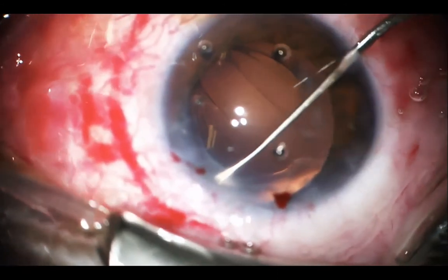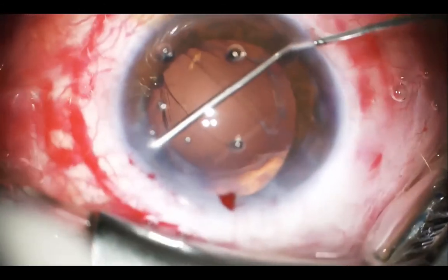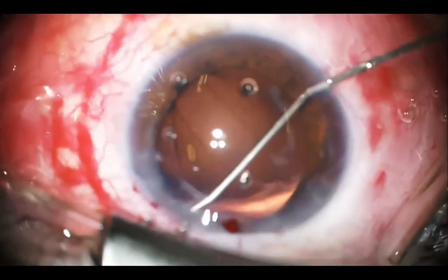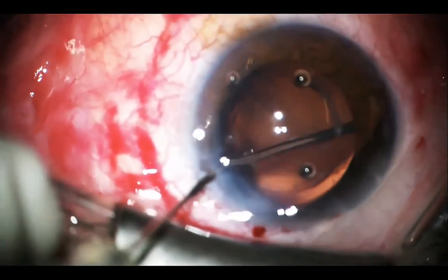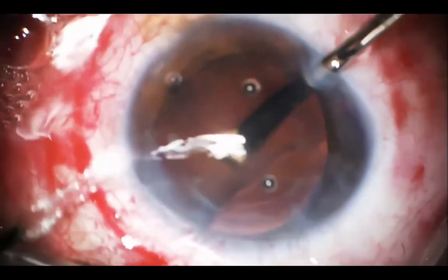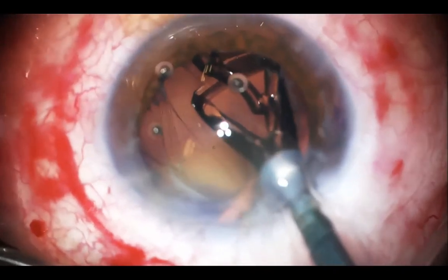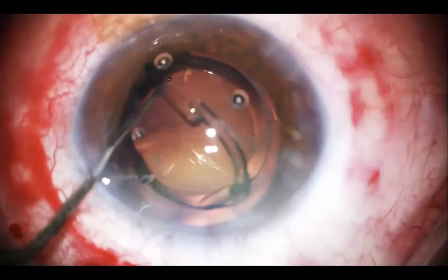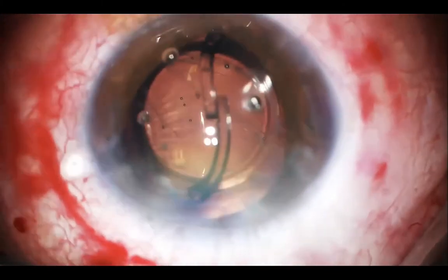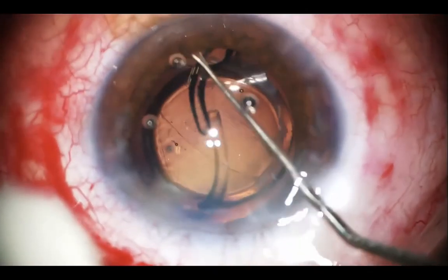So as you can see here, I'm doing the same maneuver on the other side. And it's not necessary to completely dissect the anterior and posterior capsular adhesions, but rather we have to make sure we have enough space in the capsular pockets on either side to accommodate the haptics of a single piece lens. Of course, we should do some anterior vitrectomy to clear any vitreous that might have prolapsed while doing the maneuver. And now implantation of a single piece lens inside the capsular bag on top of the open posterior capsule.